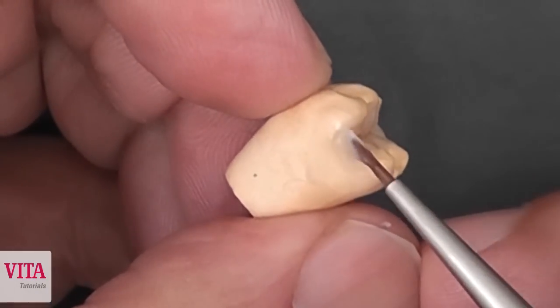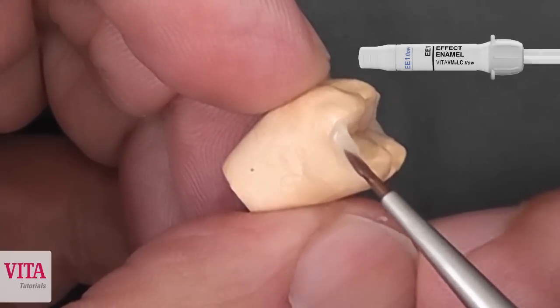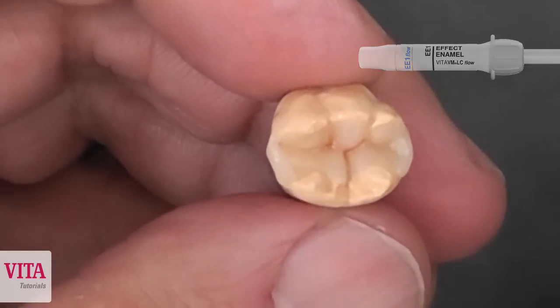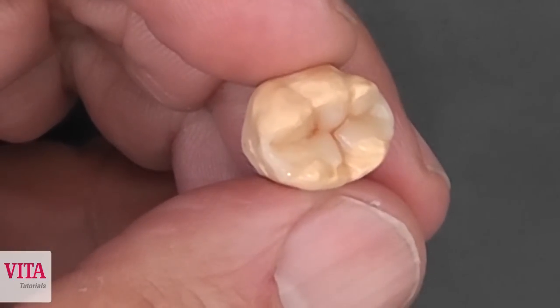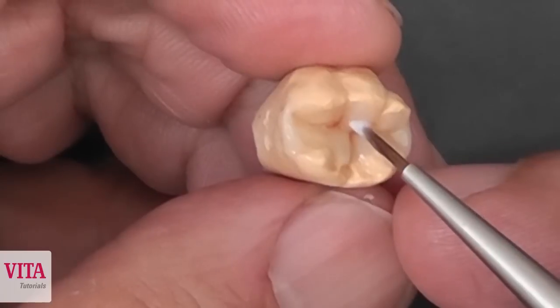The small elements — the small occlusal wedges and ridges close to the fissure — we can create with the EE-1, which is a whitish effect material and gives us the opportunity to create a really natural looking occlusion field.